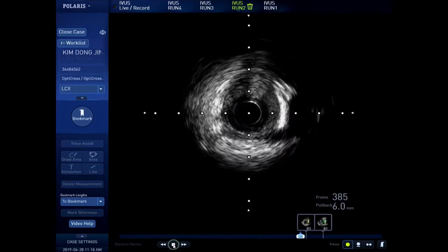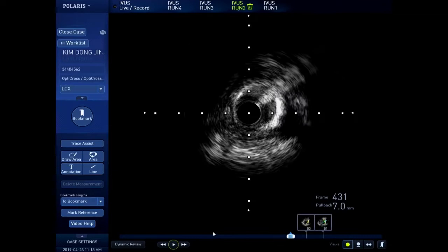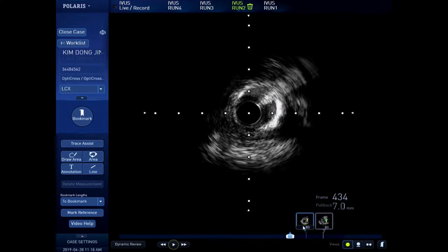Stop, please. I mean, the ostium of the circumflex is pretty small. Yeah, calcified. Yeah, it's small. The ostium is heavily calcified and tight. What about a little more distal to that? I cannot pass the catheter to the distal. Yeah, but just a little bit distally will tell us the distal vessel size. Distal, please. Vessel size is 3.0. No, please. No, previous.